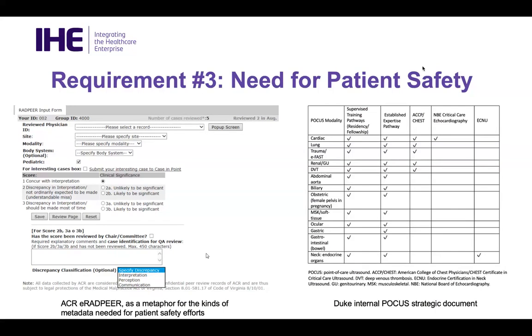It's especially vitally important when we identify providers who are struggling, because for those providers, we need to get to, let's say, all of their abdominal ultrasounds and, in a regimented, systematic way, go through all of them to really pick out how many times did they miss an interpretation, or how many times did they forget to image something, how many times did they do something that was negative to a patient, because there are remedial efforts that we have to do to bring that provider into alignment with an appropriate level of quality. So having the metadata from the encounter-based imaging workflow for point-of-care ultrasound or endoscopes becomes really critical.